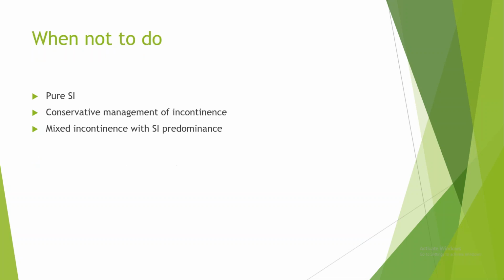So, when not to do urodynamics. The most important is pure stress incontinence. Then conservative management of any type of incontinence, and mixed incontinence with stress predominance. In those cases, you need not do urodynamics. Okay, am I clear till now? Yes, yes.